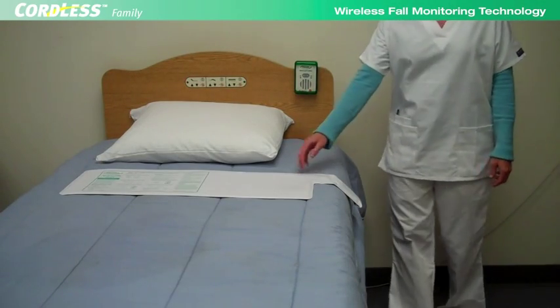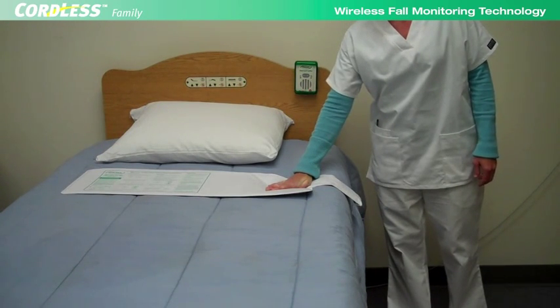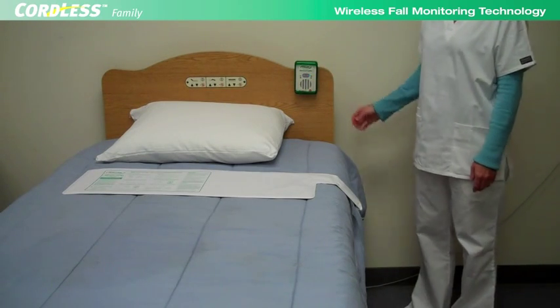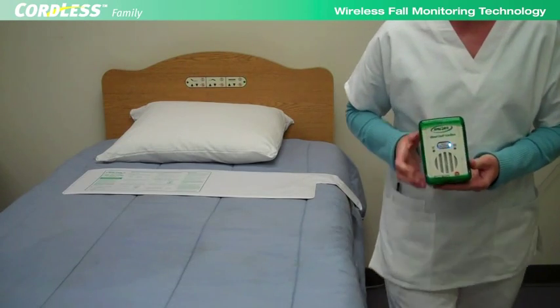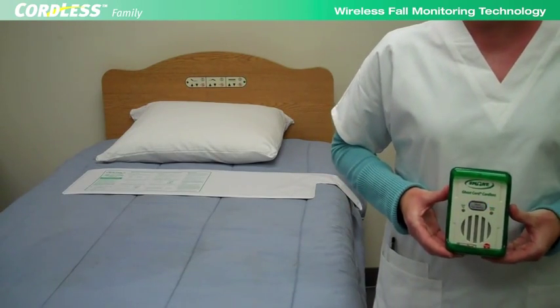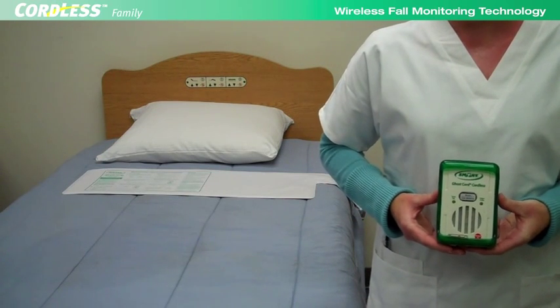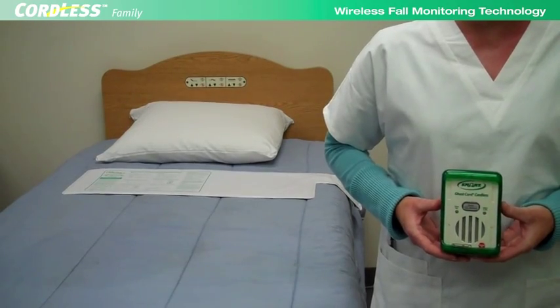The unique and distinguishing feature of the Smart Cordless System is that there is no cord between the sensor pad and fall monitor. Caregivers can now remove alarm noise from residents' beds and rooms by placing monitors in hallways where caregivers can hear them better. Monitors may be placed up to 100 feet away from sensor pads. Cordless operation also eliminates tangled cords and tripping hazards.